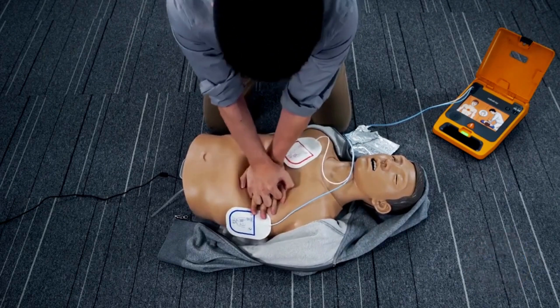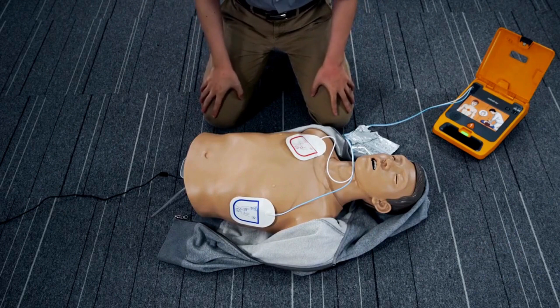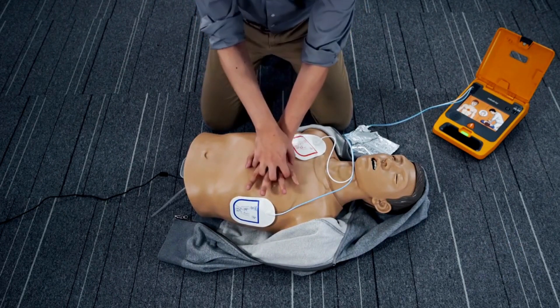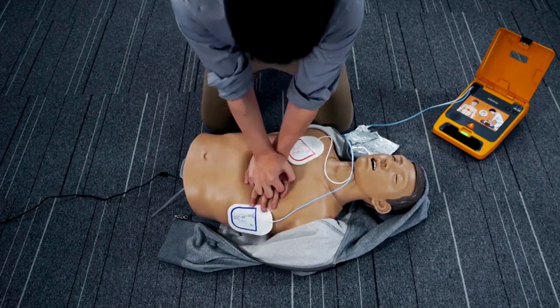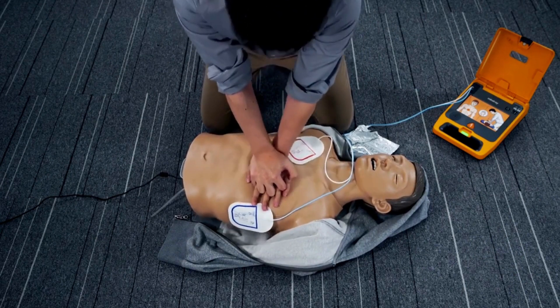Stop CPR. Do not touch the patient. Analyzing heart rhythm. No shock advised. Start CPR immediately. Follow the metronome to give approximately 200 compressions.